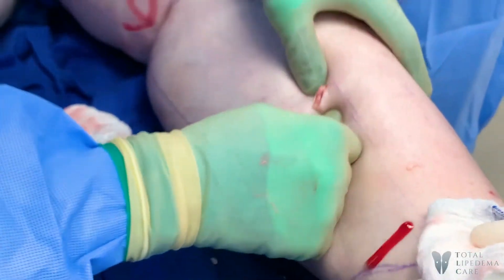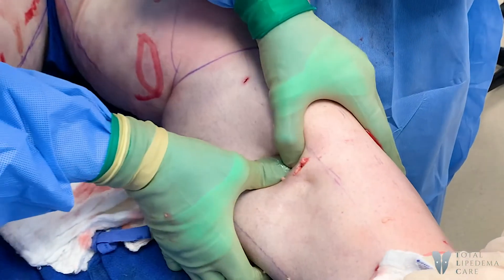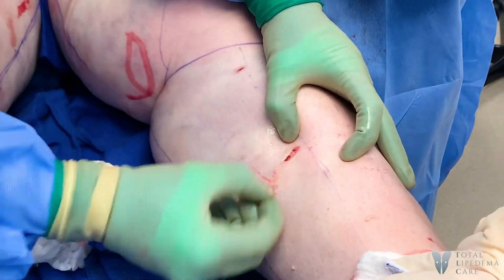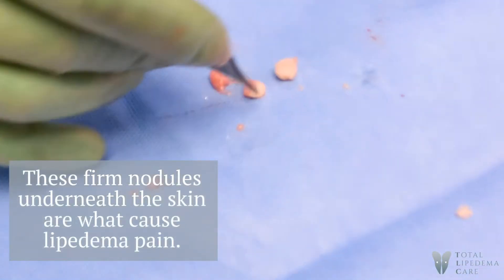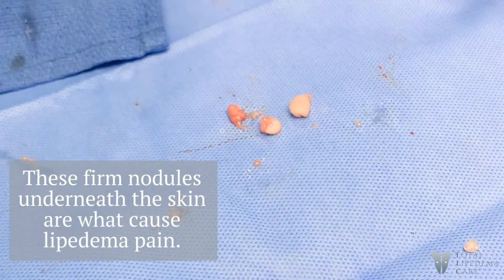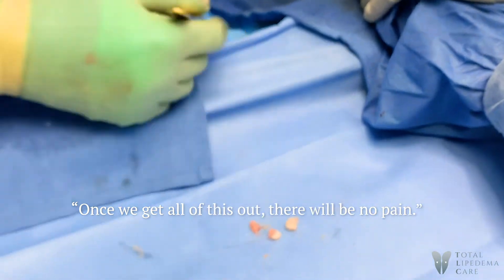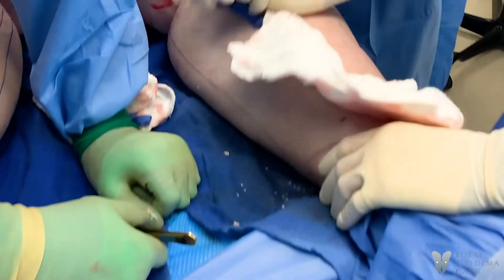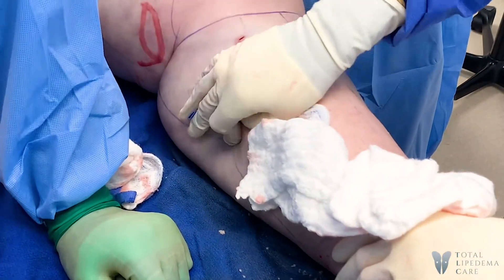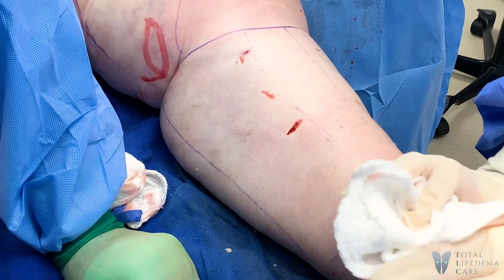We're going to get a ton more from her because it's all just thick with edema in there. As we start massaging and getting stuff out, you're going to see more and more of it. This is what I always tell people — this is the stuff you have to get out, otherwise you haven't done a thorough job, and she's still going to have pain. Once we get all this out there'll be no pain. Even tomorrow she's going to say her legs are lighter and this feels better. She told us she can walk barely half a mile — I'll bet even after we finish our first stage, she'll be able to double that, possibly triple that.